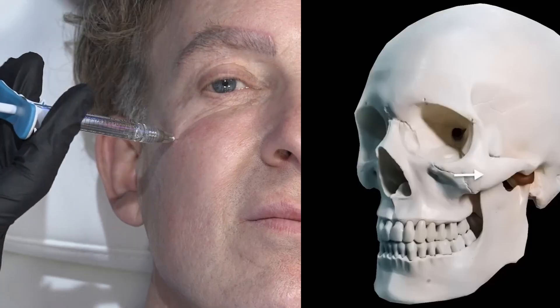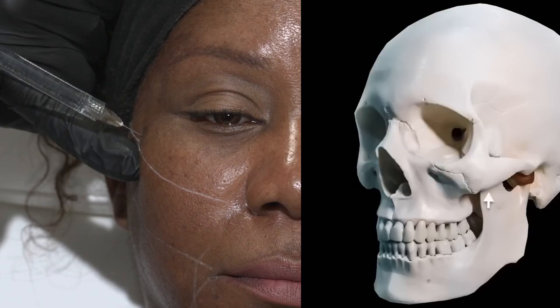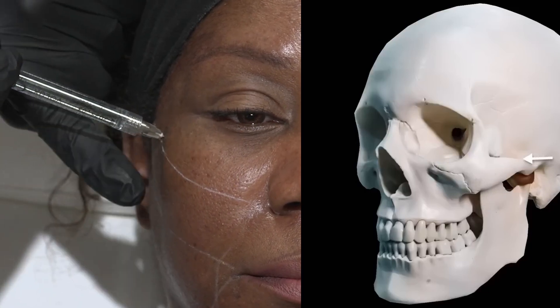Just a centimetre lateral, you're projecting in a different direction. If you're slightly higher, you get a slight upward projection. I've started, particularly in females, trying to get onto this upper surface so that I get more of an upward projection.